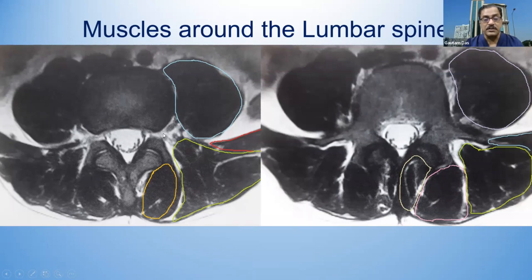So these are the three erector spinae group of muscles, and this is your transverse process in this view. Just in front of that, if you are giving an injection, that is your erector spinae block. The erector spinae block can be done in the thoracic area as well as in the lumbar area. And here, at the tip of the transverse process, the quadratus lumborum muscle starts. It runs between the two fascial planes. Anterior to the quadratus is the thoracolumbar fascia.